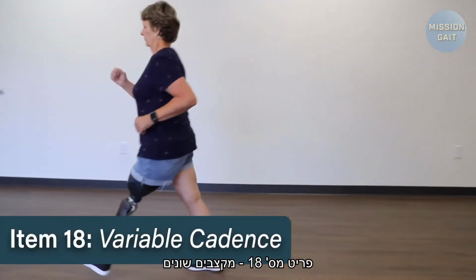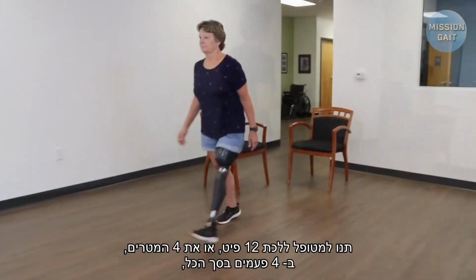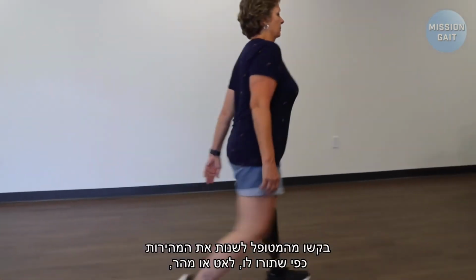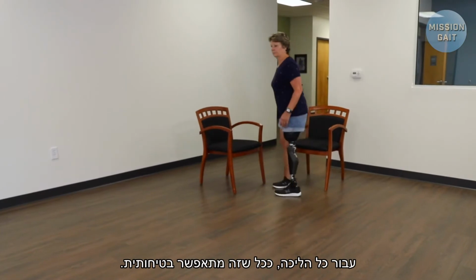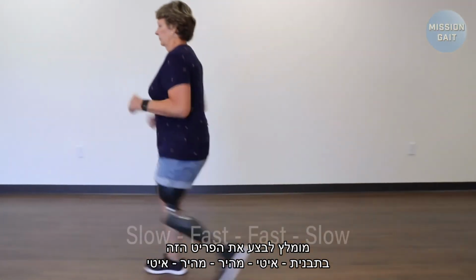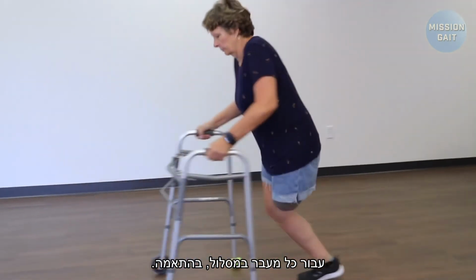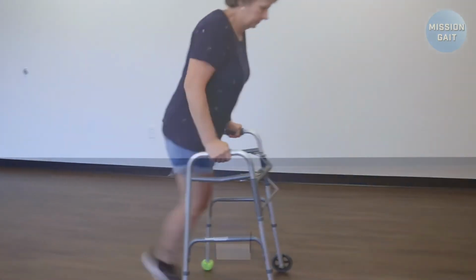Item 18. Variable cadence. Have the patient walk the 12 feet or 4-meter walkway a total of 4 separate times. Have the patient vary their speed as you instruct, either slow or fast for each walk, as is safe to do so. It is recommended to perform this item with a pattern of slow, fast, fast, and slow for each pass down the walkway respectively. Observe for changes in cadence and asymmetries.